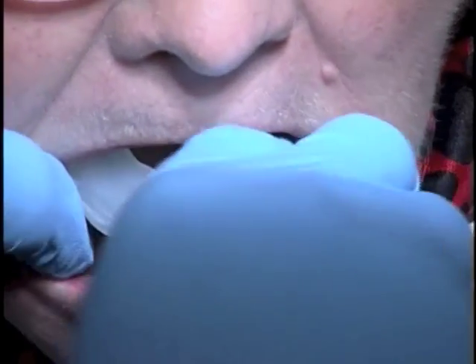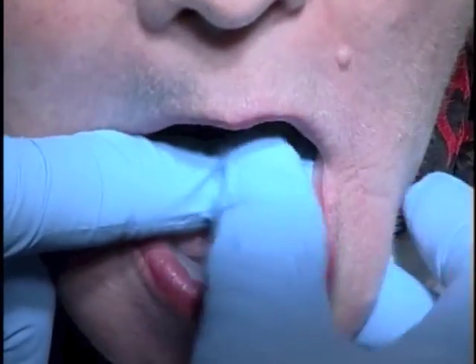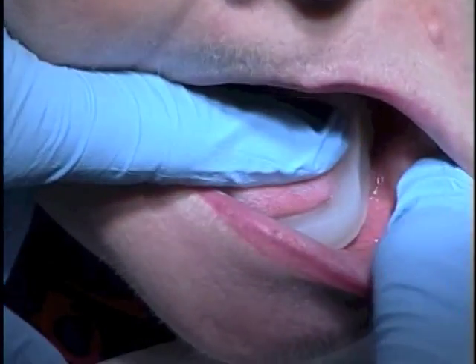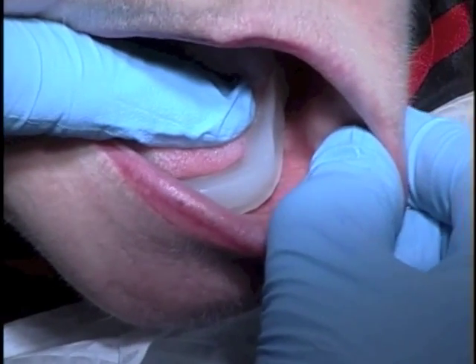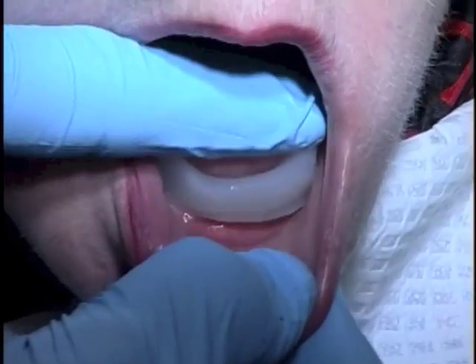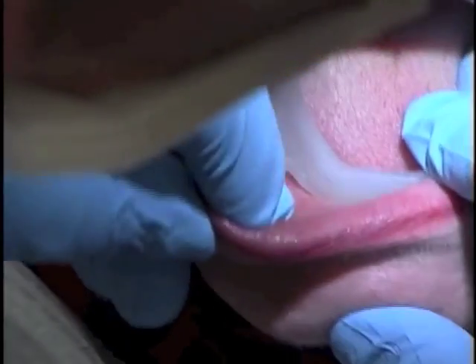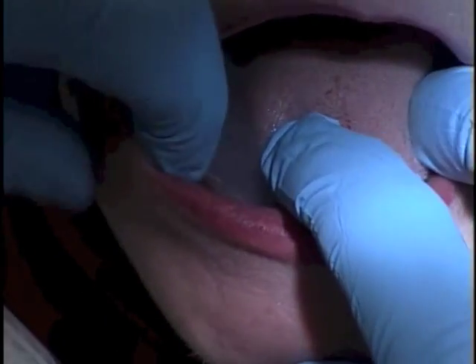Now that we've trimmed the tray, we're going to try it in the patient's mouth and see that we have a space between the tissues and the peripheral roll. And there seems to be a good space on the left side, across the labial, and a little bit on the right side.